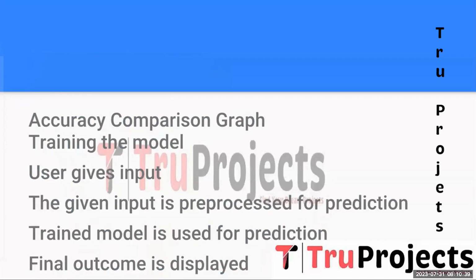And the next one is user gives the input. A Flask-based web application is developed to allow users to input the retinal images. Users can upload their images through the web interface for diabetic retinopathy prediction. And the next step is the given input is pre-processed for prediction. When a user submits an image, the input undergoes the same pre-processing steps as the training images, ensuring consistency and compatibility with the model's requirements.